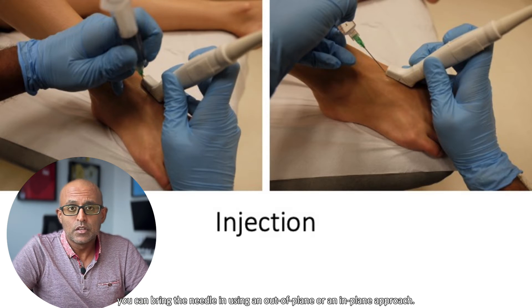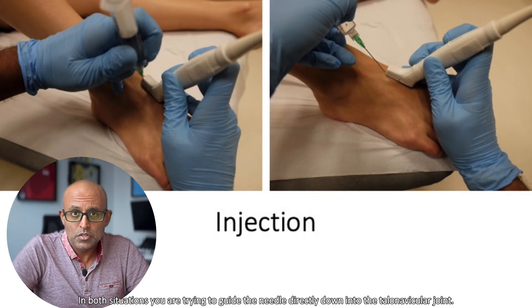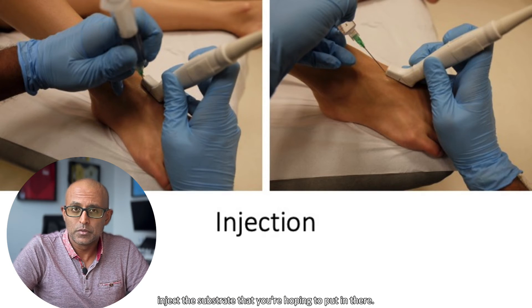You can bring the needle in using an out-of-plane or an in-plane approach. In both situations, you're trying to guide the needle directly down into the talonavicular joint. Once inside the joint, you can draw back to make sure that you haven't damaged any vessels, and then inject the substrate that you're hoping to put in there.